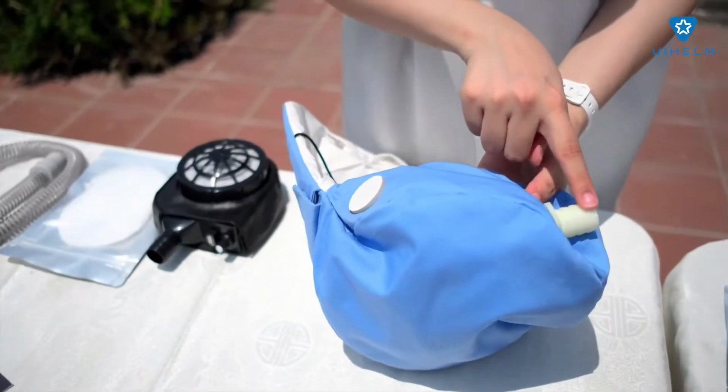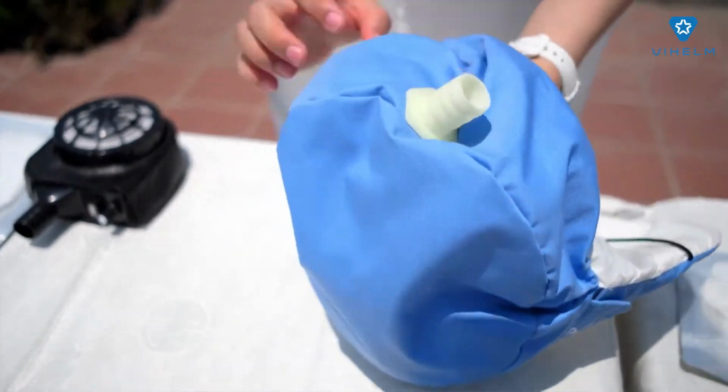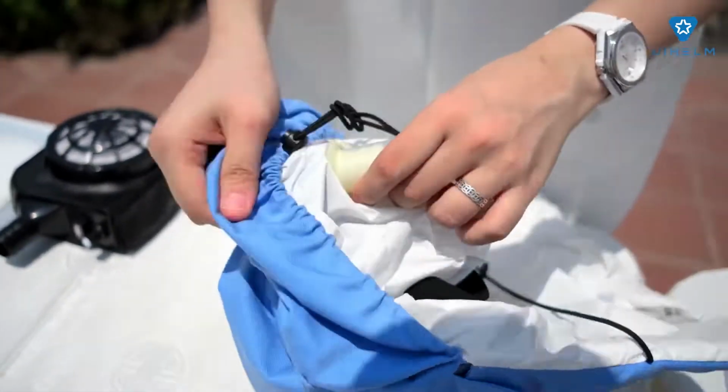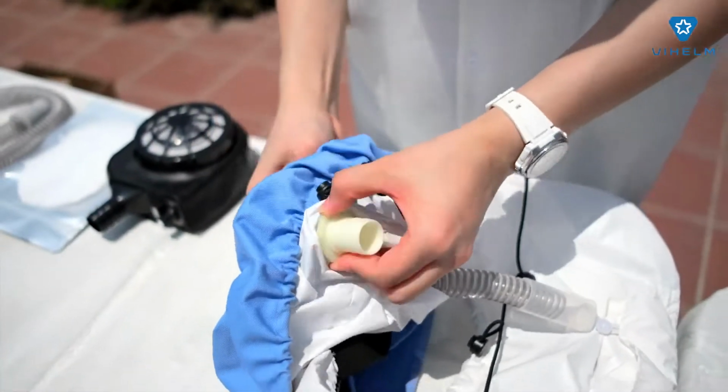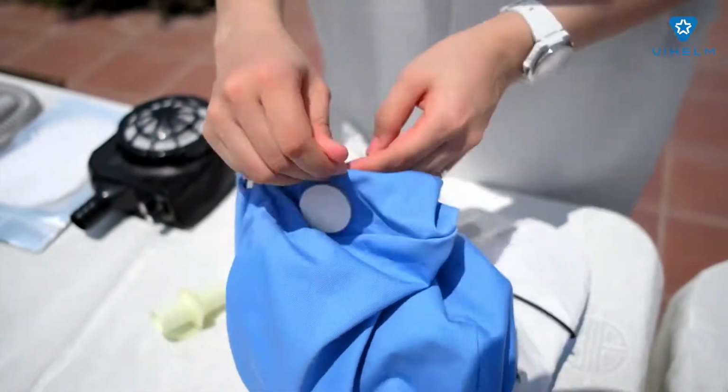If you need to rest your head on the back of your seat, on a train or an airplane, swap the adapter pipe from the main breathing tube hole to the side breathing tube hole by following these steps. Step 1. Disconnect the air hose in the hood from the connector. Turn the nut counterclockwise to remove the connector in the air hose plug.